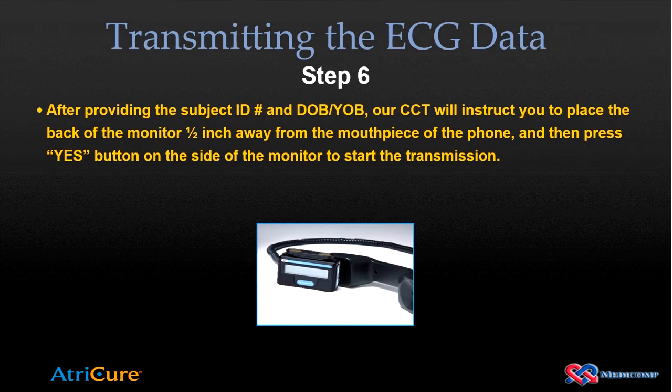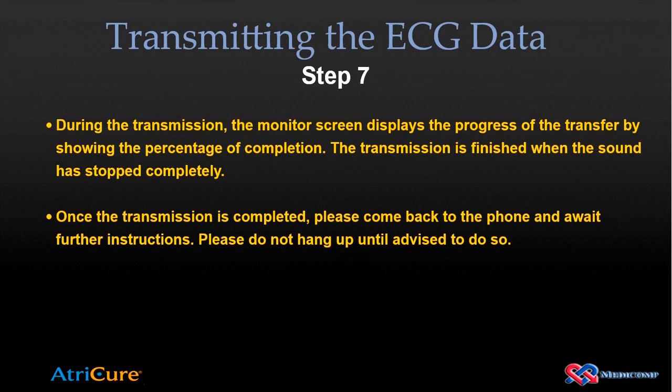As the study coordinator in training, just let the transmission go into the air. You may want to cover the speaker. When you're training your subject, you're actually taking them through the steps. So tell them that they'll hear a loud tone, like a fax machine, and you'll see the screen display the progress of the transmission in a percentage of the completion bar. The transmission is 3 times real time, so a 60-second recording will take 20 seconds to transmit. When the tone stops, the transmission is done.